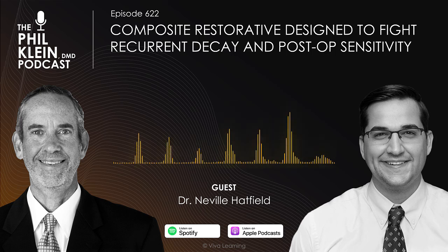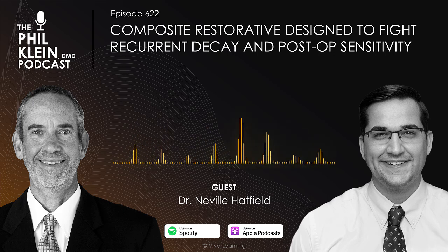So tell us why you think that's important as a restorative dentist and someone who does a lot of direct restorative procedures. Is it just for those cases you're concerned about where the patient has a history of high-risk caries, or is this something that has enough aesthetic qualities, very high aesthetic qualities, where you can use this routinely? So obviously the bioactive component is very important to me in my patient population. I do have patients who are high risk. I have patients that are low risk.